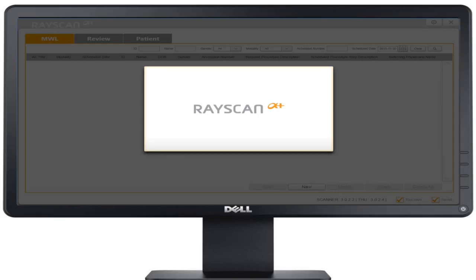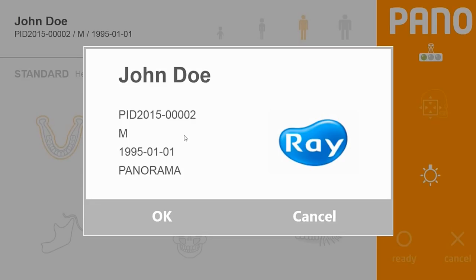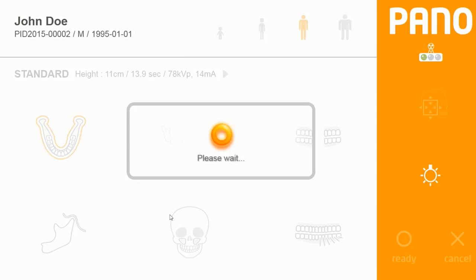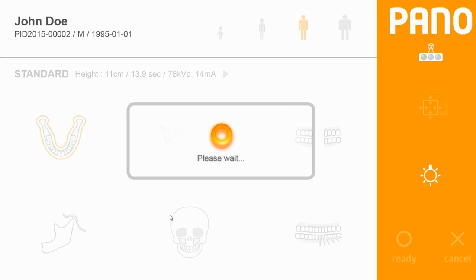Set up the acquisition from within your imaging software. The first screen shows patient information — simply click OK. You will notice the machine is initializing. If the machine was not reset to a home position prior to going into this interface, the machine will initialize itself for you.